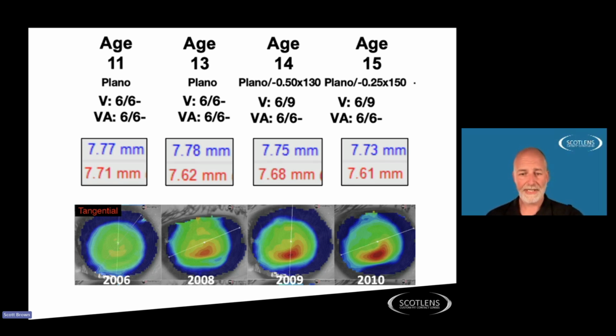So we can see with this that clearly in year 2, when this patient is 13 years old, they are developing keratoconus. At this point now, they would be referred for cross-linking, which would stabilise that, which would mean that they would maintain that level of vision and that cornea effectively for the rest of their life. In 2008, cross-linking wasn't available, so this patient went on to progress. But this shows the significance of topography, where we're getting the whole view of the cornea rather than just this one metric.